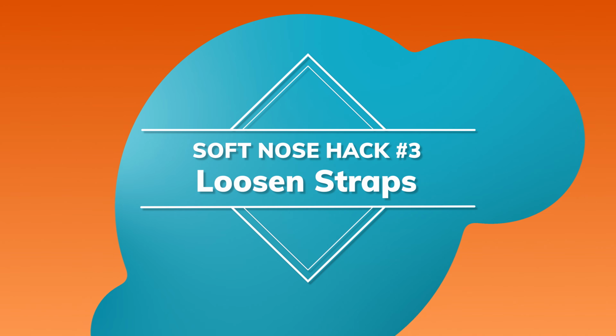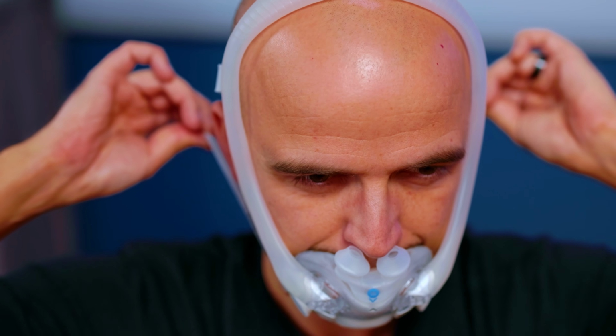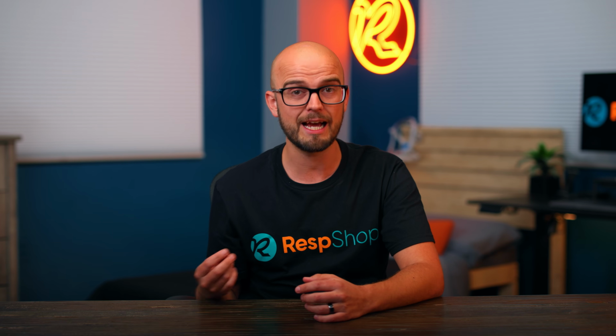Hack 3. Loosen your straps. A tighter seal pulls the cushion against your nose, which can squish it in more and create gaps in the seal where the air can leak out of. It can be a case of getting better positioning without tightening too much.